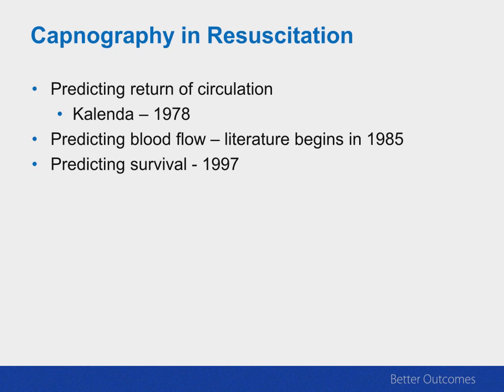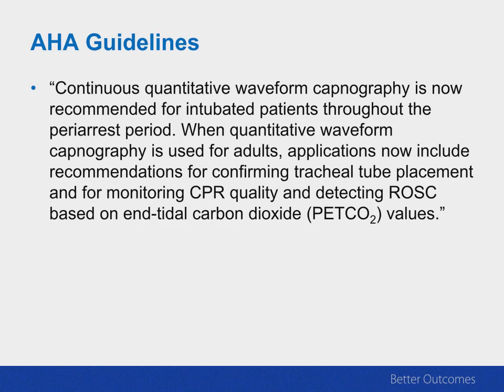A paper was published, and research has been studying this for several decades, but a really good paper came out by Levine, Wayne, and Miller in the New England Journal of Medicine in 1997. What they said was something very simple: if the end tidal level doesn't rise above 10 after 20 minutes of resuscitation, there were no survivors. And this is something that many investigators, including us, have looked at over time.